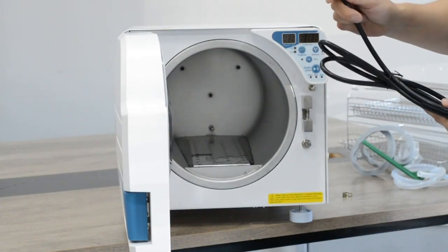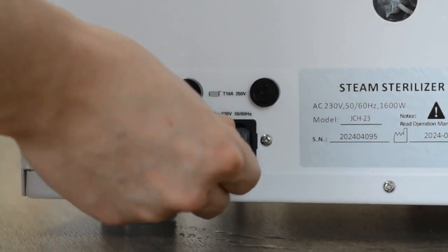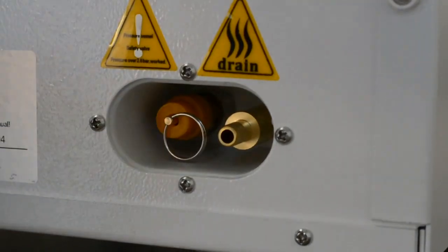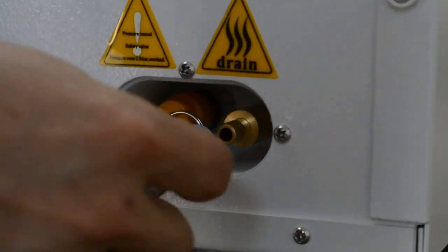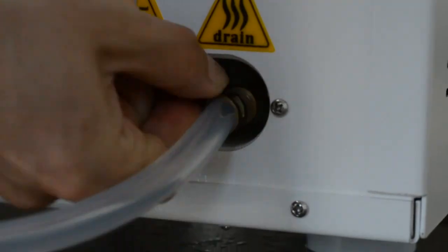Then we connect the power cable to plug inside the socket. Then we need to fully insert the drain tube and use the connector to secure it.